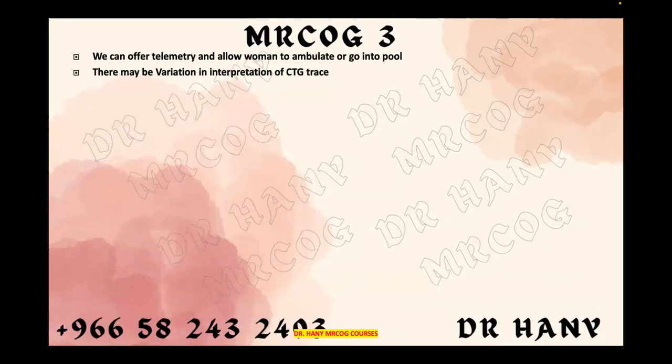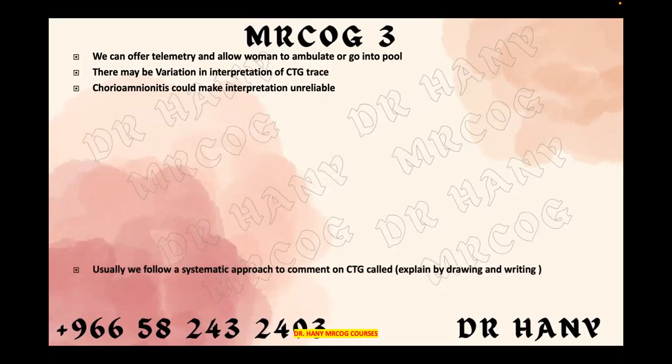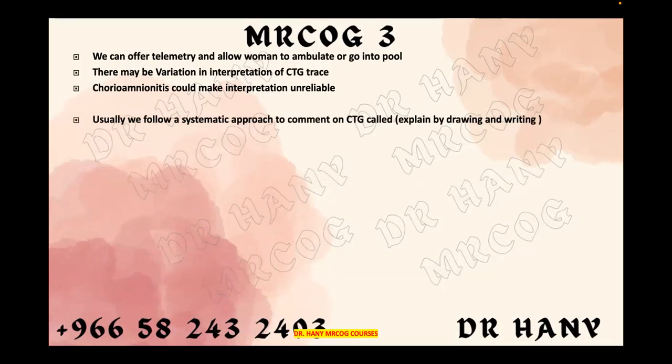There is much variation in the interpretation of the CTG. That's why you need to follow or stick to the guideline. Chorioamnionitis can change the interpretation of the CTG. Usually, we follow a systematic approach to comment on the CTG, and that's DR C BRAVADO. First of all, the DR. C BRAVADO is a good approach to follow.